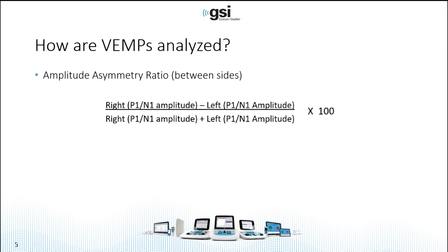While the VEMPs are collected differently, they're analyzed similarly, in that an amplitude asymmetry ratio is calculated — which is the difference in amplitude between the right and the left side. You can also obtain an OVEMP threshold, and there are other ways to analyze, but the asymmetry ratio is the primary measure.